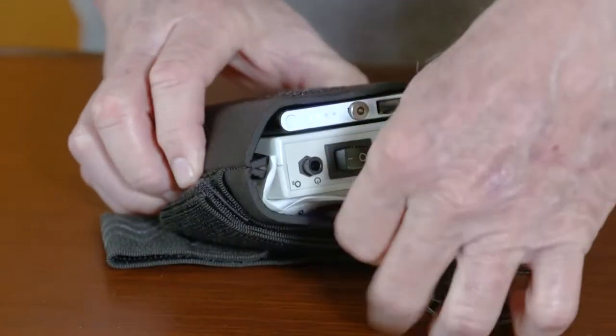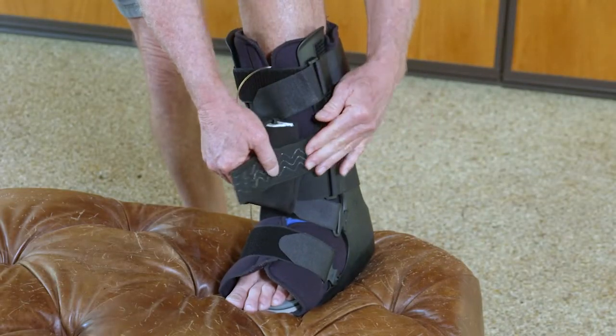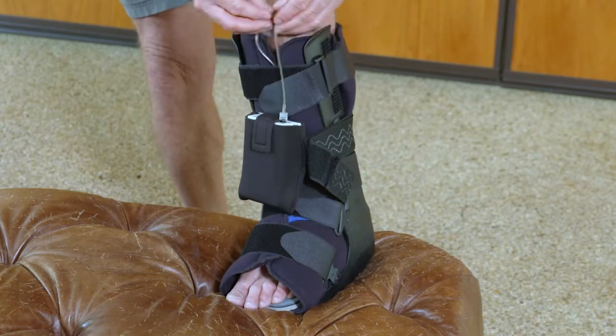Please see the charging video for further instructions. Here's a tip: this carrying case can also be strapped directly to the offloading boot, potentially eliminating the need for the extension set.